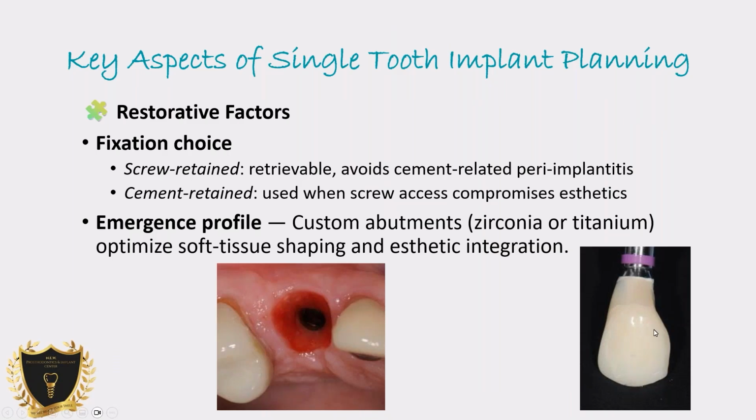This is an analog, and I'm customizing the site for an implant. So you need to make sure it looks like a CEJ and crown on a natural tooth, the way it looks on the root. You cannot just put a pre-made or prefabricated healing abutment and be done. You can customize at the time of surgery or do soft tissue profiling after.